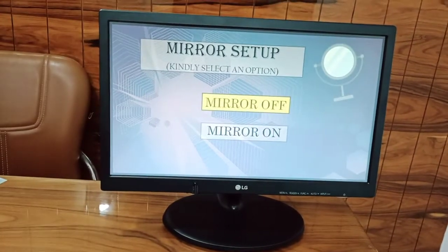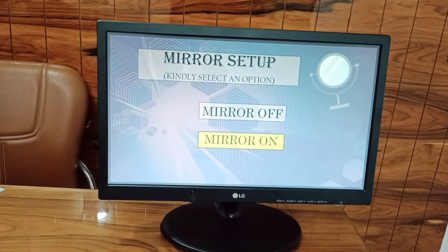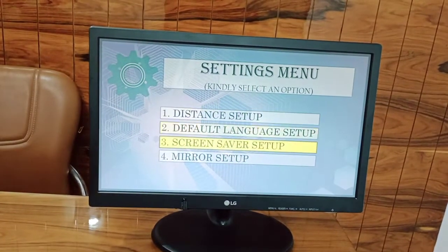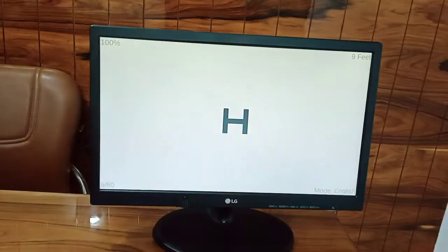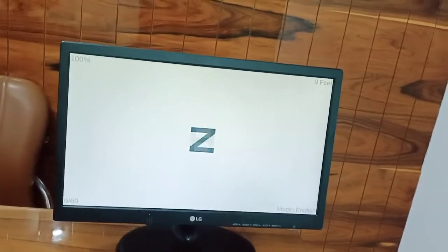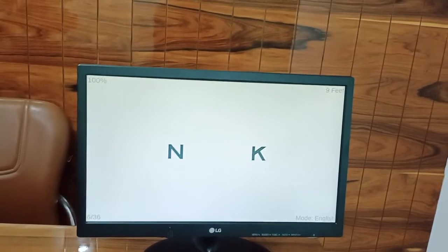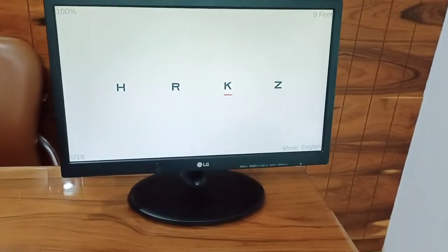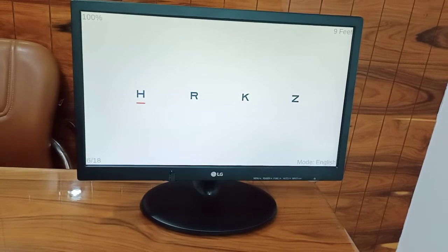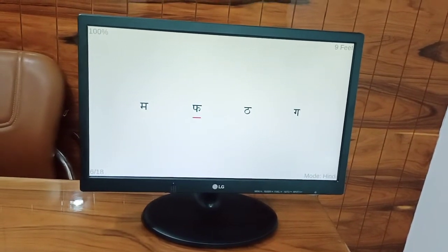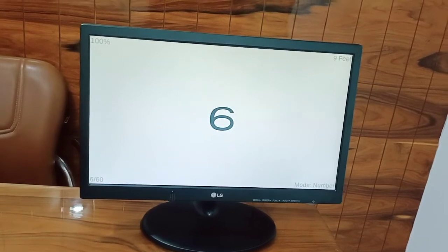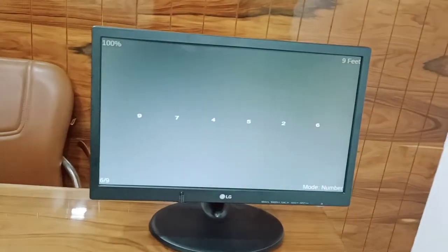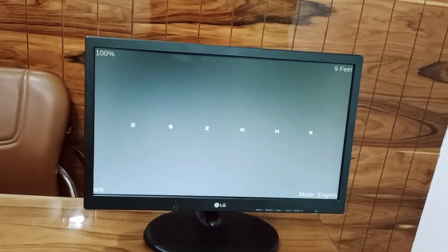You can use the mirror option also. Mirror of English language — points are available. Hindi language, numbers — you can invert also: English, Hindi, and number modes are all available for inversion.